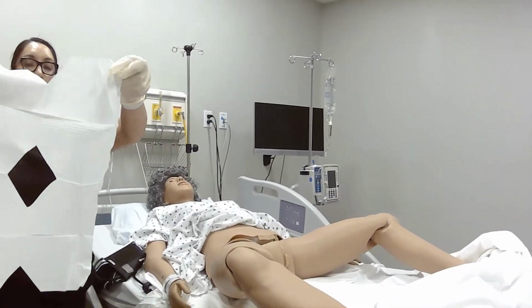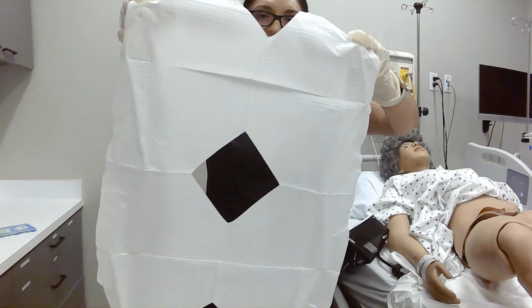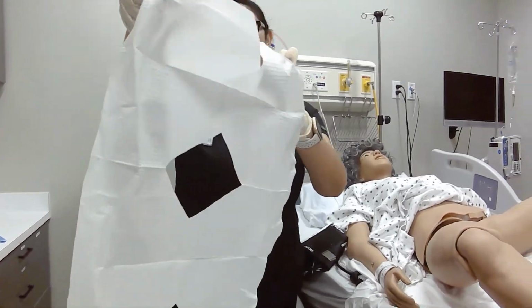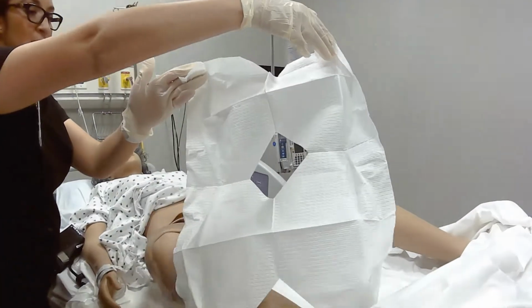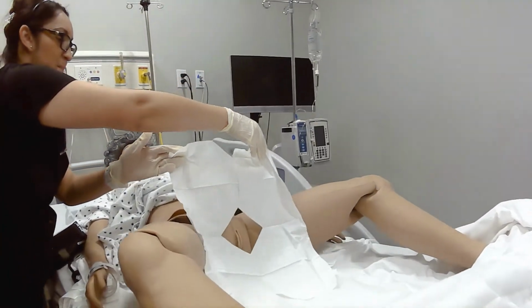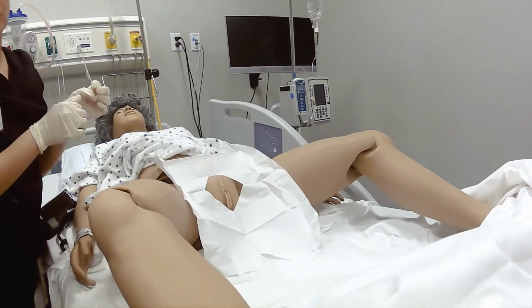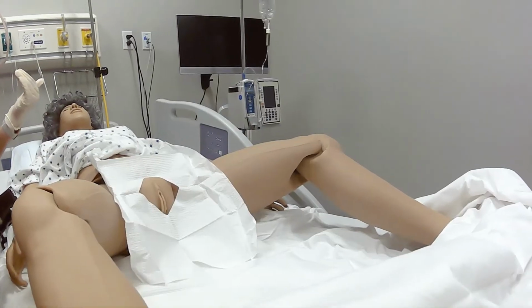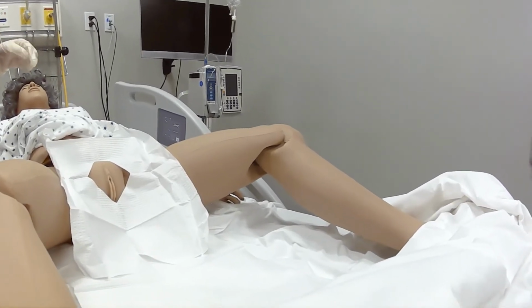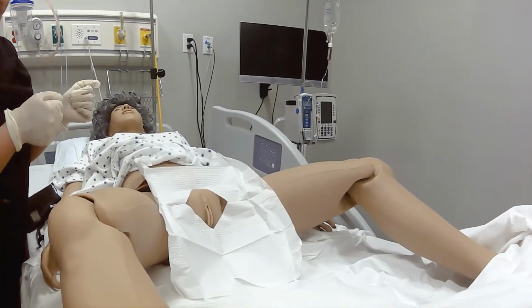Okay, so the fenestrated drape does not have a shiny side, so it doesn't matter which side you use. Okay, and this is going to be brought over to the area of the patient, and you're going to place it right over the genitalia, whether it's the female patient or a male patient. Okay, and it's an extension of your sterile field.